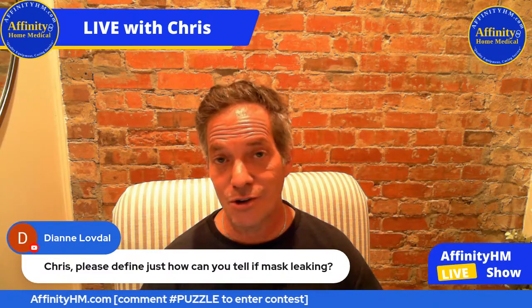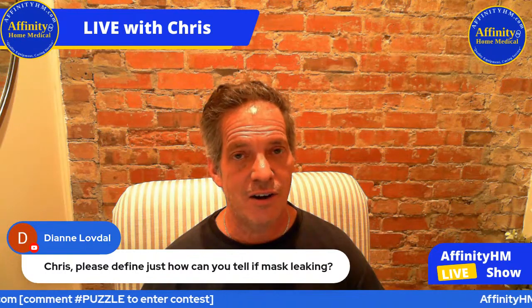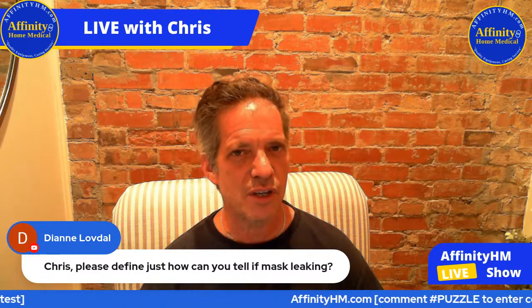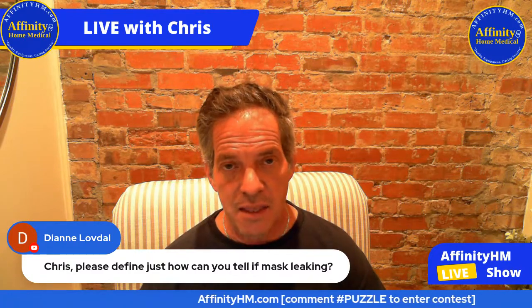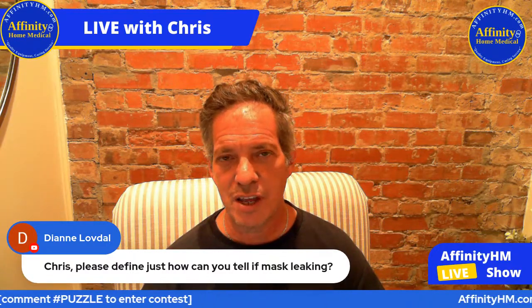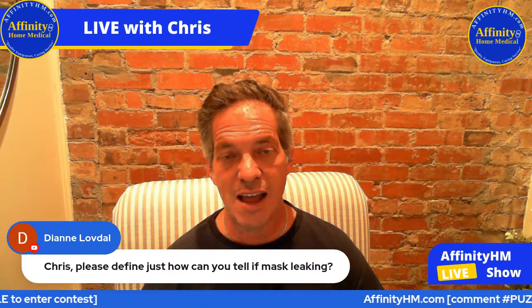And the best way to determine an air leak is really with your ears. You will hear an air leak before anything else. So if you're not sure, if your hearing isn't really great like mine, then you look at your data, and there's going to be a place somewhere that you can see on your screen. It's going to tell you whether or not you are having a leak.